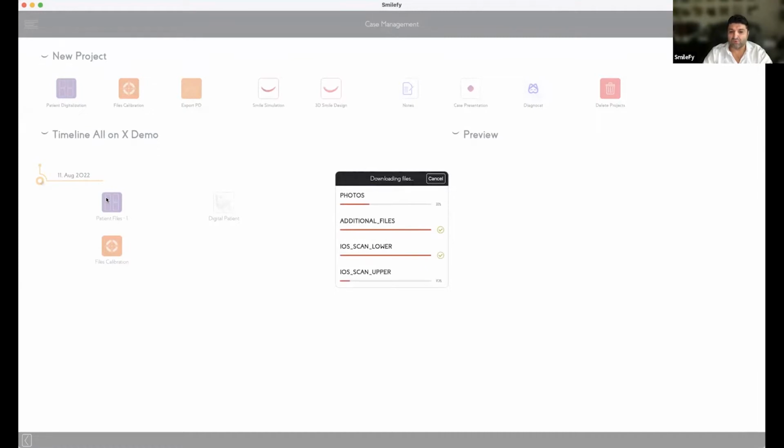The frontal facial smile, because we want to design the smile, whatever we design, full arch implant bridge or the smile, facially driven, we need enough space in the mouth to design the smile, to analyze the face, to analyze the lip, and then to design the smile. That can be a challenge because patients cannot open the mouth properly.